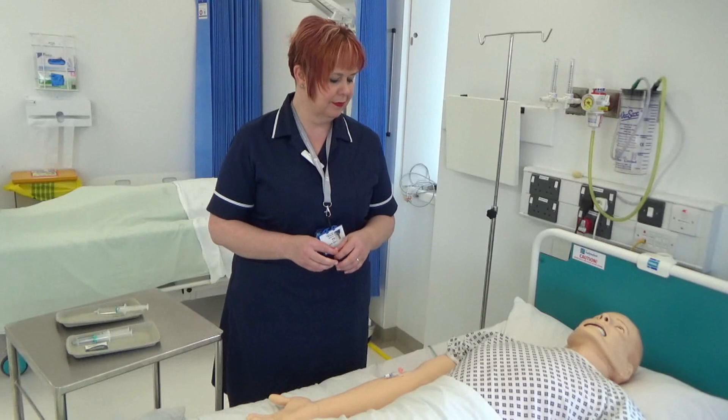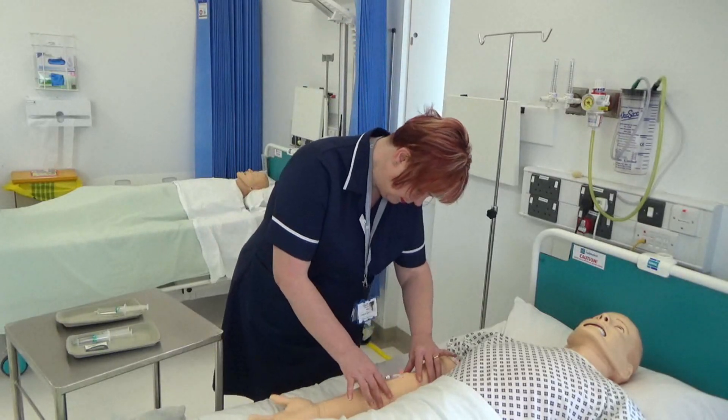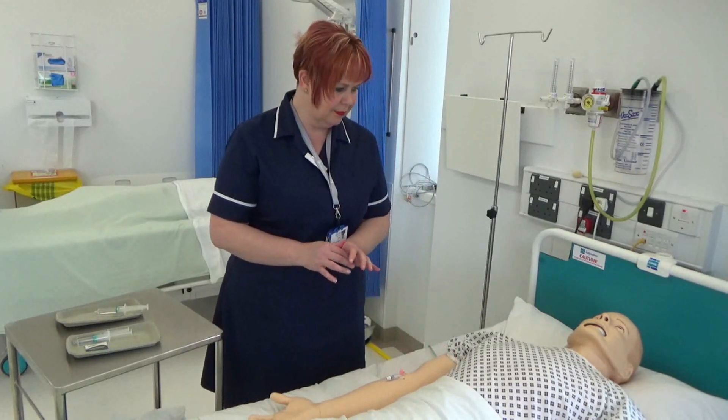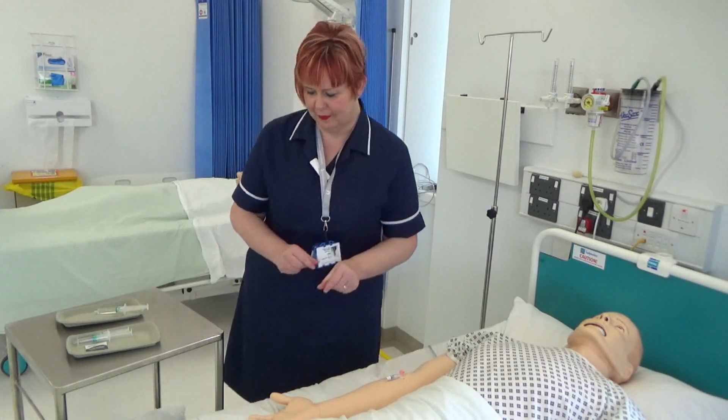Inspect the insertion site of the cannula. This is to detect any signs of inflammation or infiltration, and if those are present, the appropriate action must be taken as per the care plan. Again, clean hands as per policy and apply apron and non-sterile gloves.